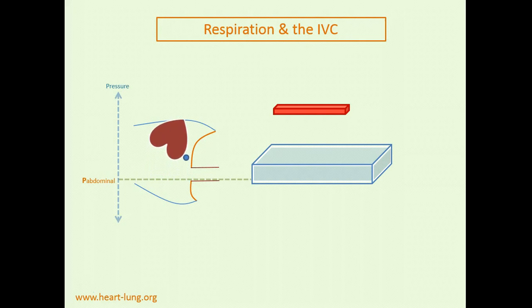So the right atrial pressure may fall below intra-abdominal pressure and then rise above intra-abdominal pressure. So you may see IVC collapse, but it's hard to standardize this because patients will have varying effort, varying lung and chest wall compliances, varying degrees of PEEP applied. So that will complicate things. So let's go back to our baseline.